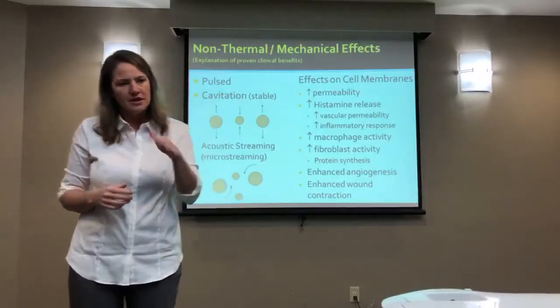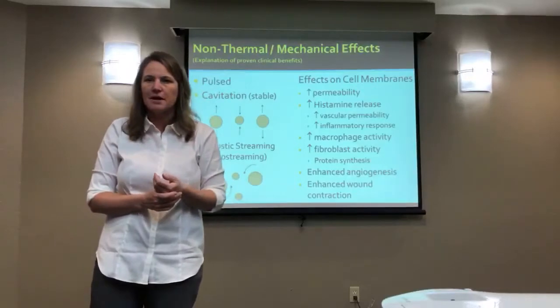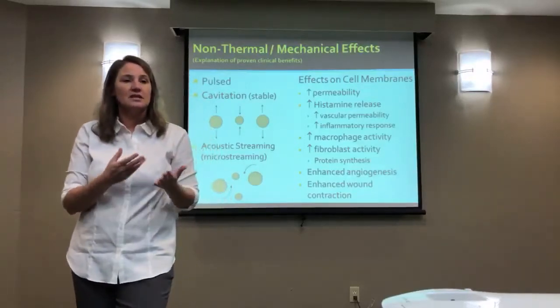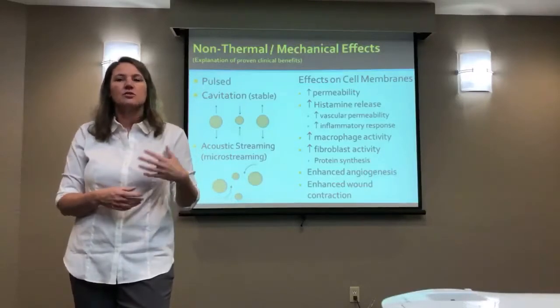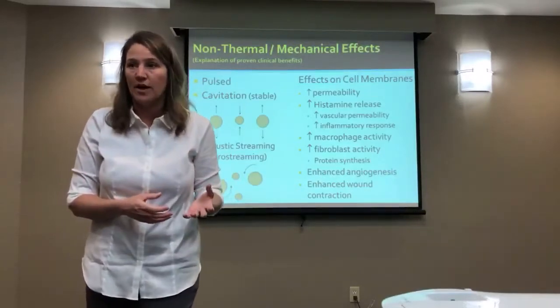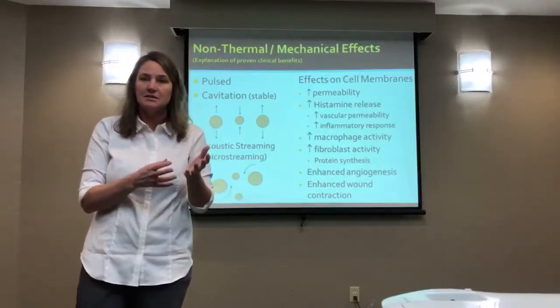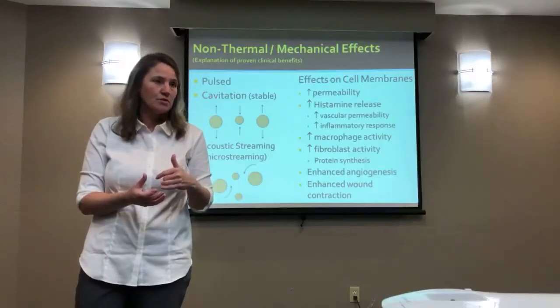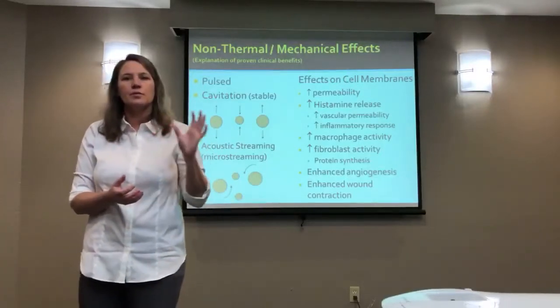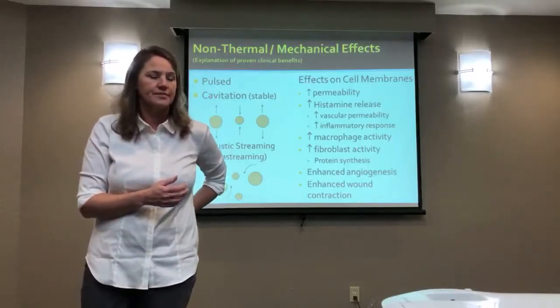Okay, so when you put all of these characteristics together, it basically amounts to wound healing, tissue healing. And so that's what you're looking at, is even without heat production, you can take damaged tissue, which you may not want to increase blood flow anyway. I mean, the reality is you may not want to heat this type of vulnerable tissue anyway. So these are the ones where you want to promote healing, but you don't want to promote heat. Those are the ones you would use this non-thermal effect on.